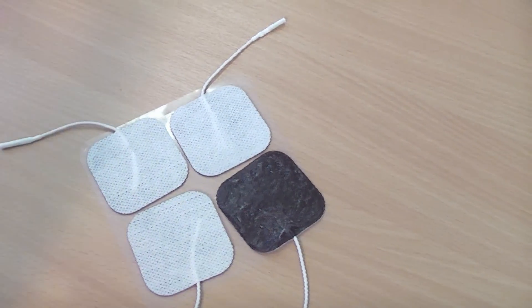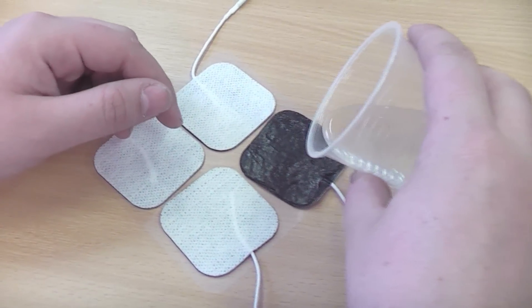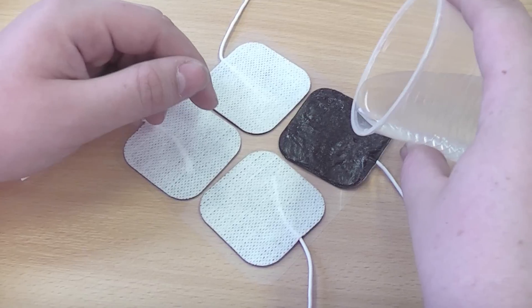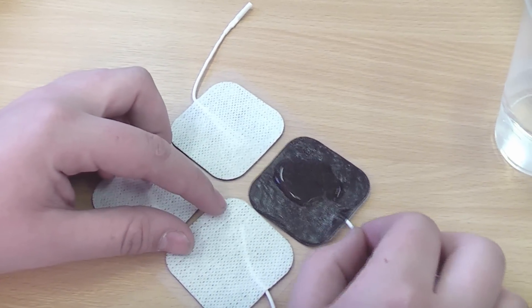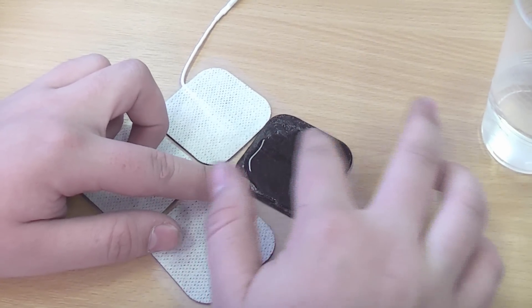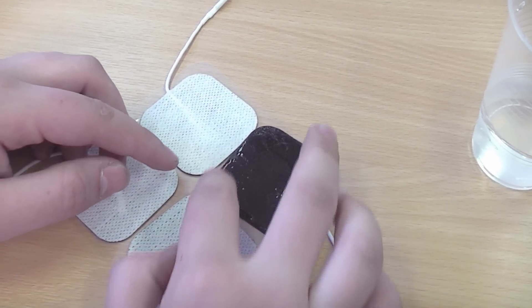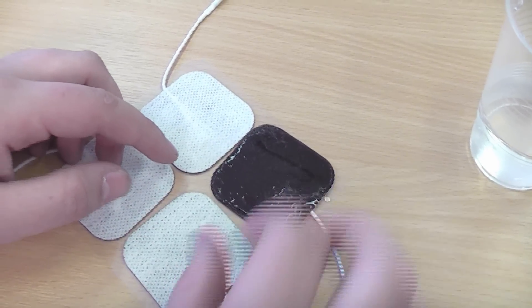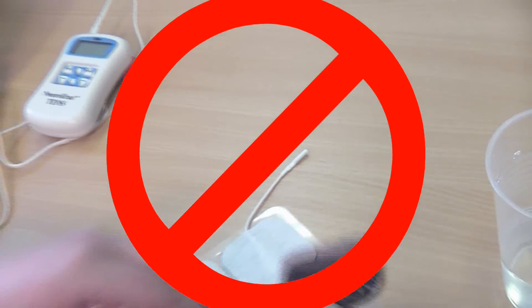Dry electrodes can be saved to an extent by dripping a small amount of water on the black side of the electrodes. Leave them upside down like this overnight and the gel will absorb the moisture, returning the stickiness to them. Eventually they will have to be replaced, but by doing this their lifespan can be massively increased. And most importantly, never use wet electrodes.